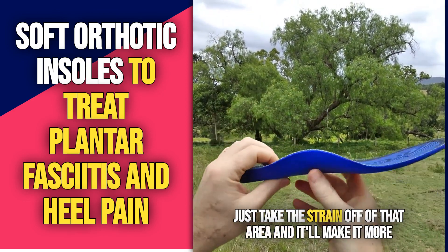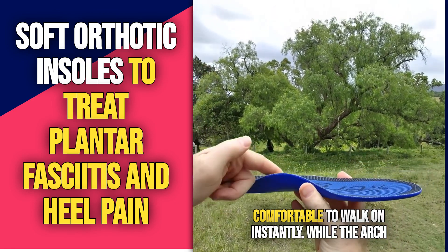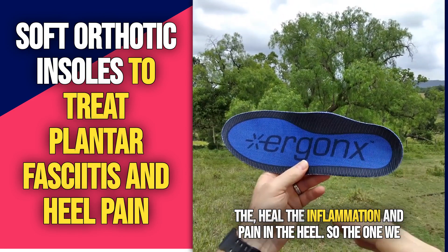This helps to just take the strain off of that area, and it'll make it more comfortable to walk on instantly, while the arch support will help to rest the plantar fascia and help to heal the inflammation and pain in the heel.